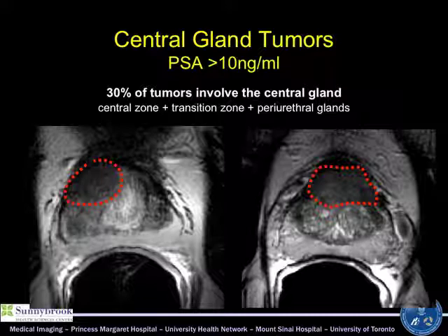I will say that there is an argument for doing deep non-selective biopsies or non-image guided biopsies, so you take a longer needle or push in further with your random biopsy. Incremental yield in our experience there has not been great. Transperineal anterior directed biopsy yields have been good though. So if you've got a setup where you have OR access, we can do transperineal biopsies for these, that's another approach.